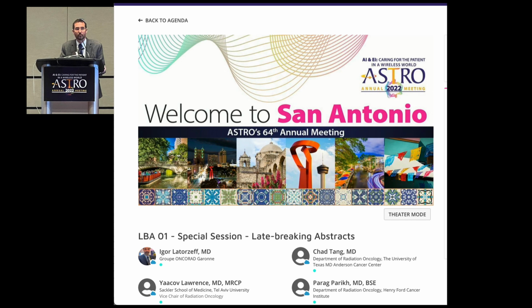Yeah, sure. So first of all, we tried to be pragmatic. So we said in the protocol, ideally do 4D and 3D simulations, intravenous contrast, but we appreciated that wasn't always possible. And it was possible to do a simple 3D simulation without contrast that was good enough. In terms of the time of treatment, we treated at the maximum dose rate possible on a TrueBeam, which I forget what it is, but the FFF mode. And typically we completed treatment within 8 minutes. At my center, we treated over 80, 90 patients, and I don't recall any patients who couldn't complete the treatment.